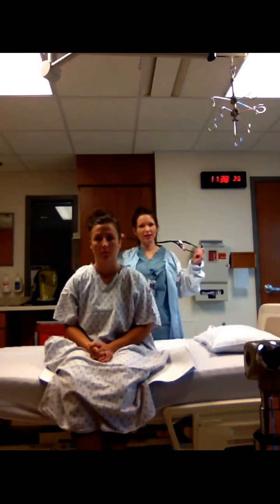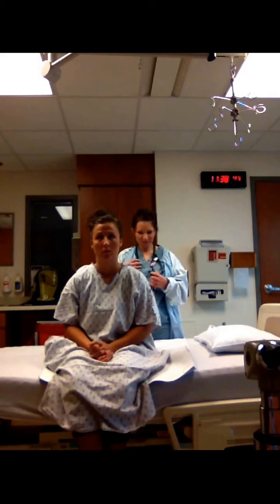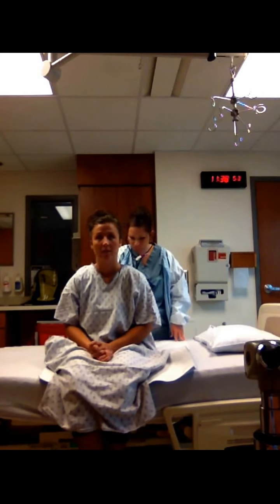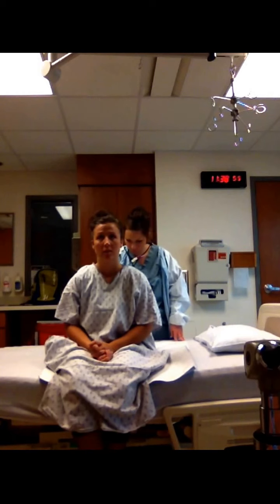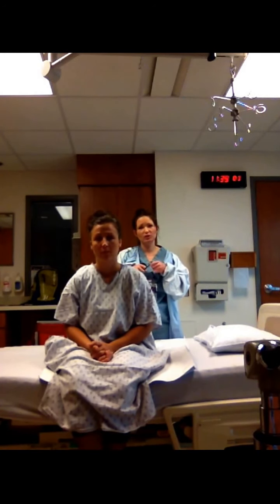We're also going to be checking for bronchophony, egophony, and the whispered pectoriloquy. Courtney, when I lay my stethoscope down, I want you to say 99, okay? 99. 99. 99. Okay, and that appears to be soft and muffled, which is a normal finding.